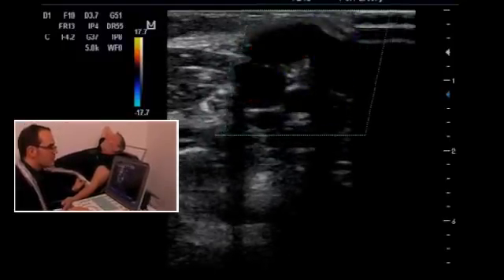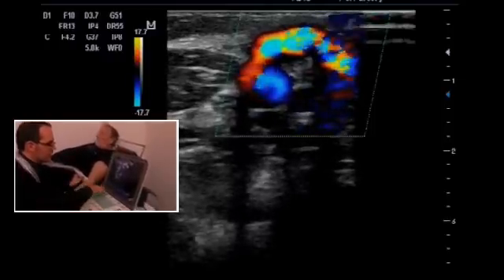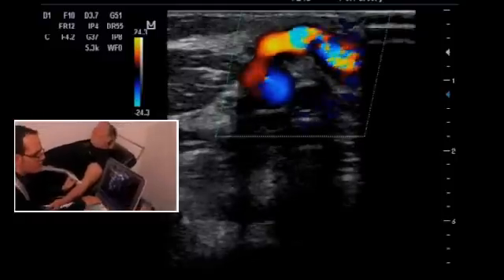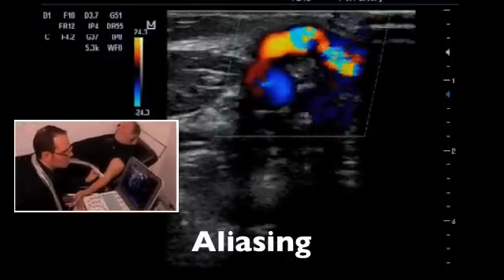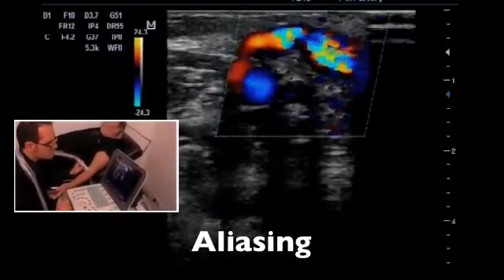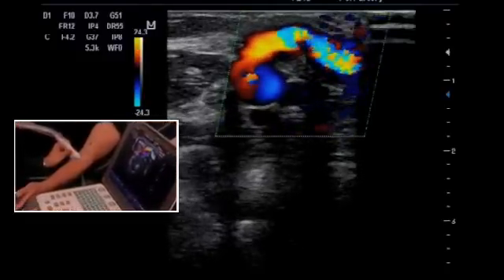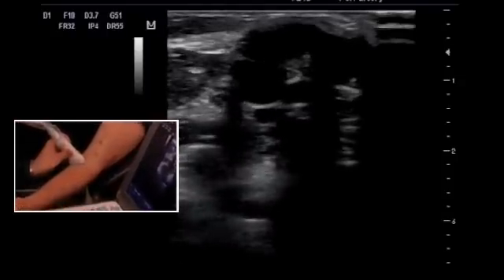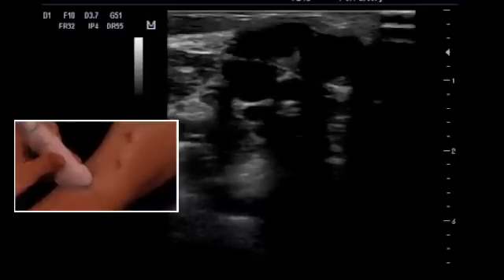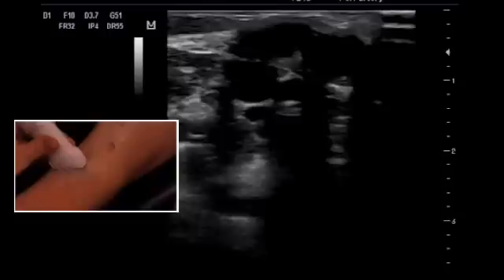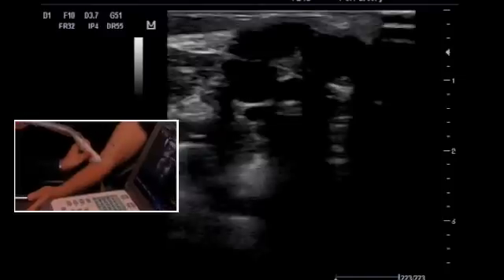In the post-anastomosis region we see a zone with really high flow velocities — this is aliasing. So here we can suspect a stenosis. We also suspect this stenosis in the B-mode, where we can see a narrowing of the blood vessel.